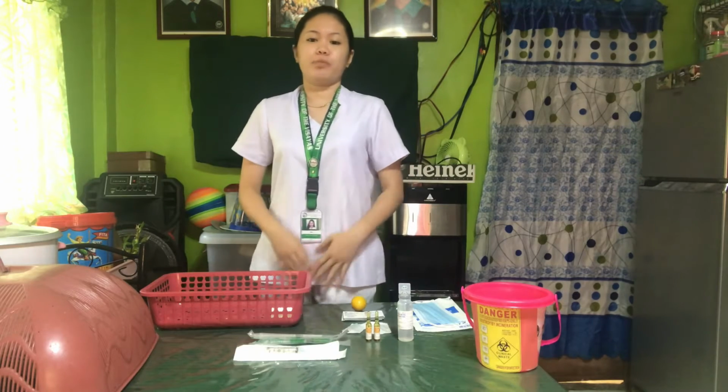So prior to carrying out the procedure, we have to prepare the things and equipment that we will be needing in parenteral medication administration. So I have gathered here the things that I will be needing in the following procedures.